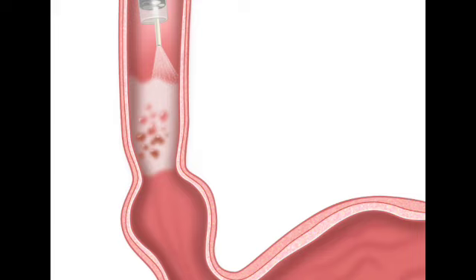That's a really good way to put it. It basically covers itself in white paint. Yeah. But why? I mean, what is the actual mechanism causing fleshy pink tissue to suddenly turn white just because it got misted with vinegar? It comes down to how the acid interacts with the cellular structure of the tissue. Okay. To understand the mechanism, think about what happens when you crack a raw egg into a hot pan. Or, actually a better example, if you were to drop that raw egg white into a bowl of vinegar. Oh, the clear gelatinous egg white suddenly turns opaque and white. Precisely. Because the proteins are reacting. The structure of the protein is literally changing.